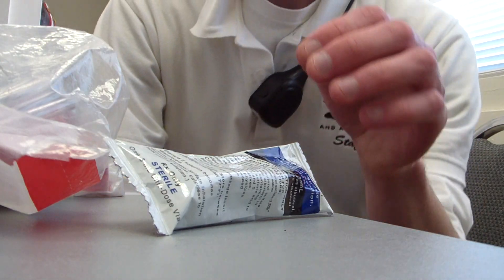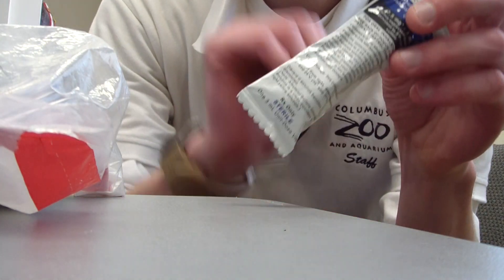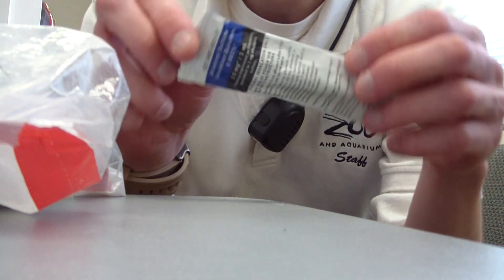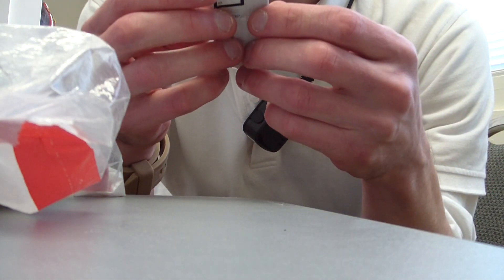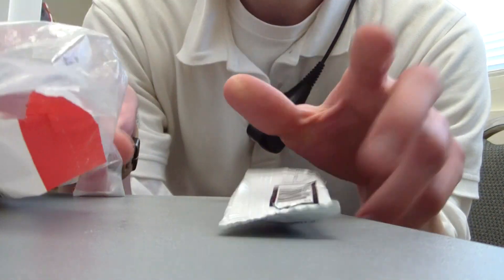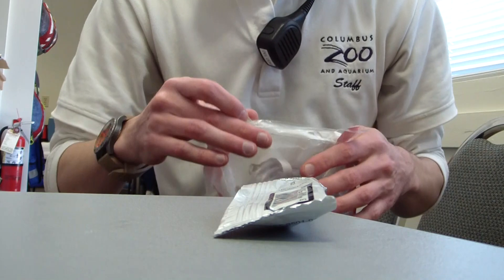For today we're going to set up a nebulizer and how to administer albuterol. Make sure your contents are still sterile and make sure the expiration date is still good. Same way it goes with your nebulizer.